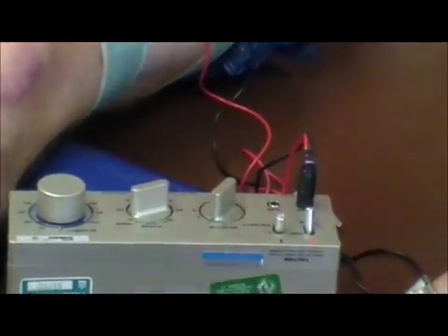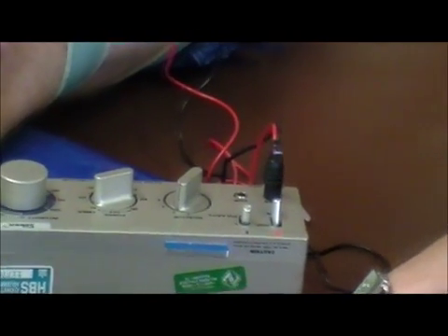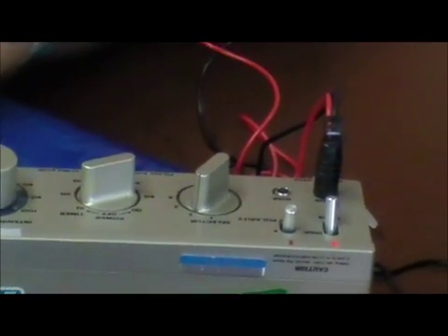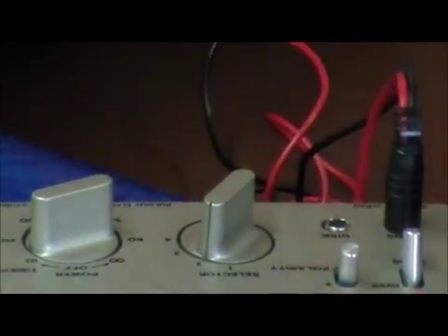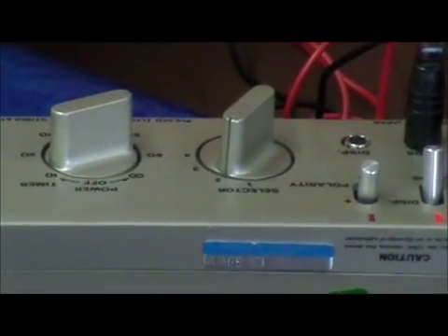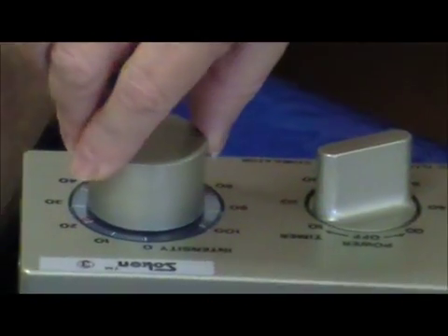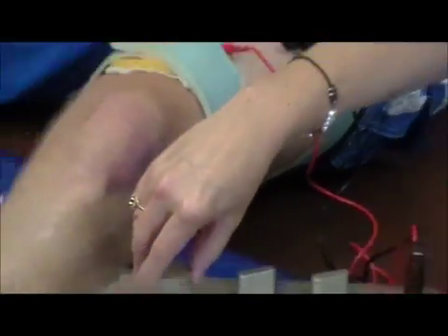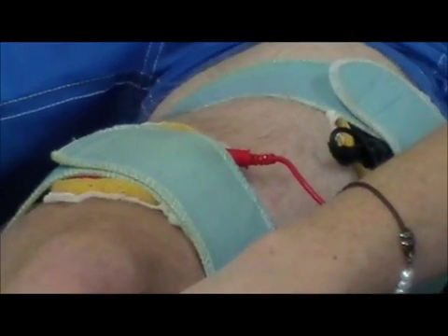Selector 3 is continuous low rate. It's going to look like a heartbeat in this muscle if we turn it up to a motor response. It's not going to grab and hold, it's going to thump. The intensity tends to be different on a low rate than a high rate, so it probably won't be the same, and I don't want to switch selectors while it's still up there. So we go to 3. It's doing it on its own. There we go.